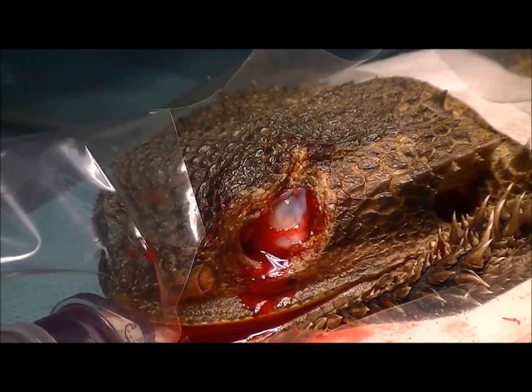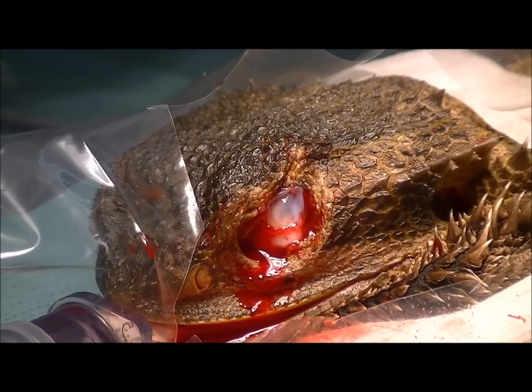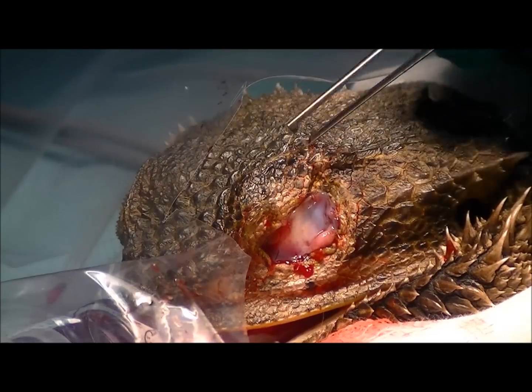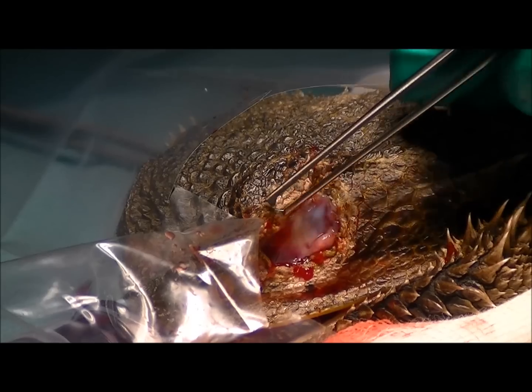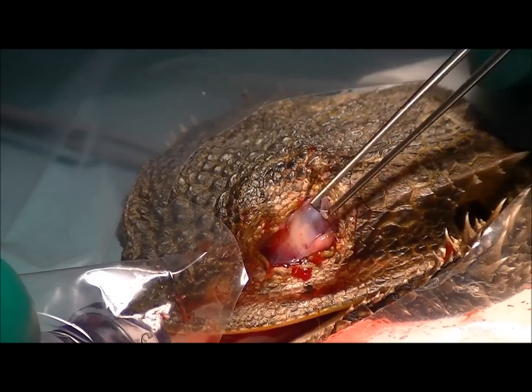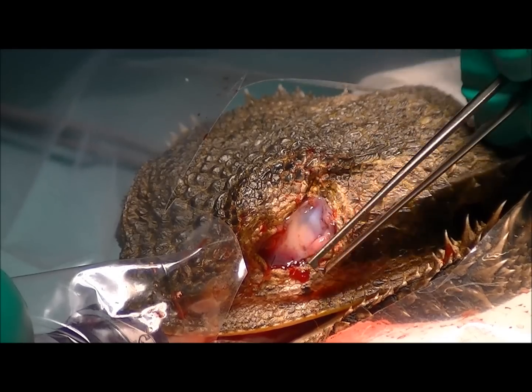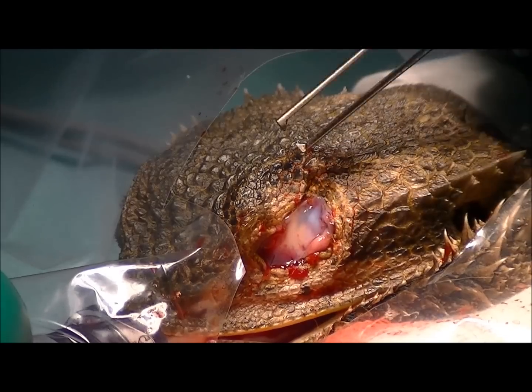Ultimately these cosmetically heal up really well and the lizards that have had this surgery go on and live a normal, healthy life. We've finished stitching around the eye — the third eyelid is now positioned all the way around and forms a nice cover over that hole. It certainly looks a lot better than just leaving it as a big open gaping hole. This will scar over and we'll get some skin growing over that, and in the next couple of months it will be completely fully healed.